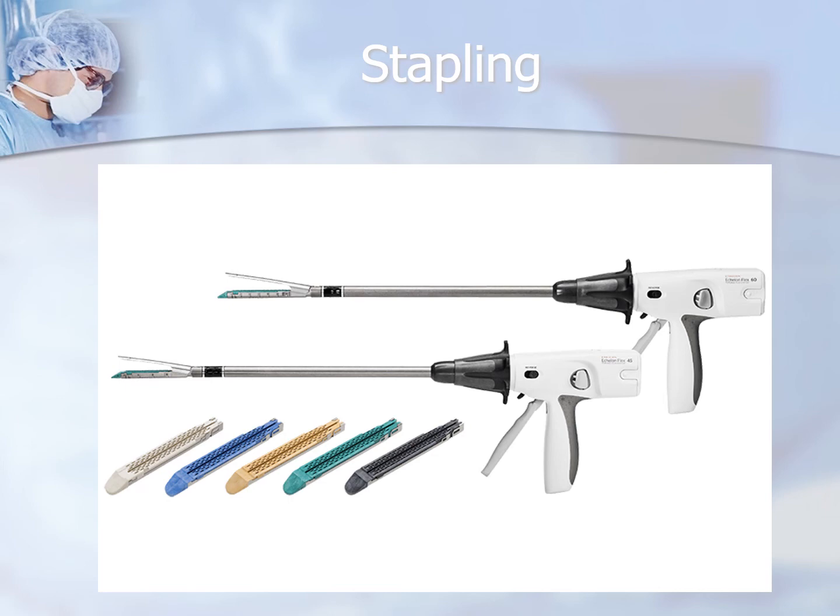And you can see how they have these different colored cartridges down here. They have different jobs that they do. Some are vascular, some are more for adipose, some are for heavier tissue, and it does indicate that on the packaging. And these can be reloaded into the tips of these devices. These are single-use devices, though.